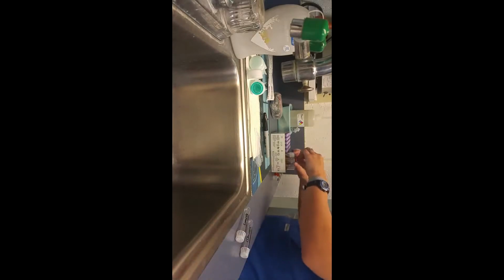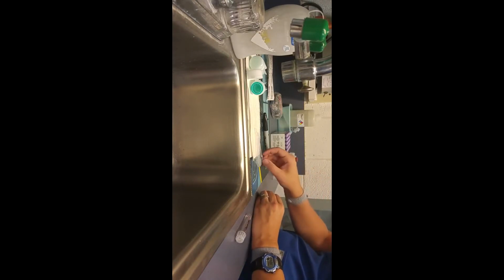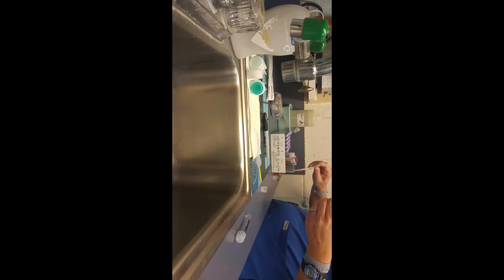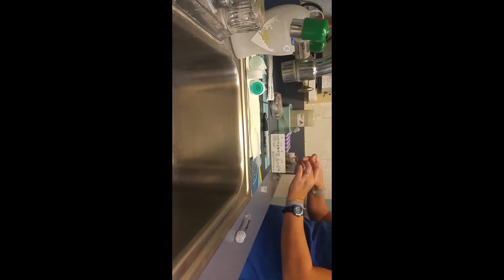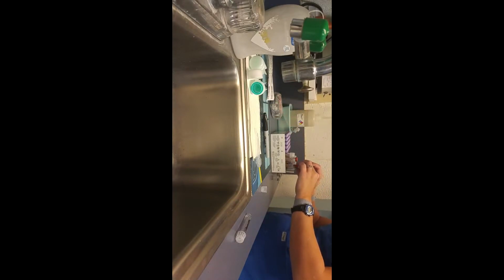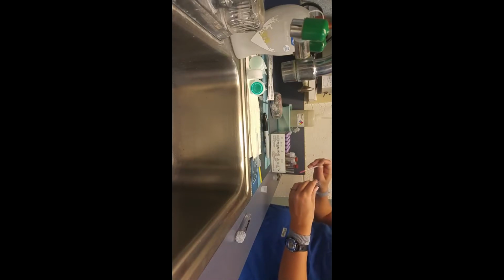Okay, so we're going to go ahead and set up controls. Go ahead and do the donor's control first, which is this tube here. This is indeed the donor. Two drops of the donor's red blood cells, which is indeed what this is.